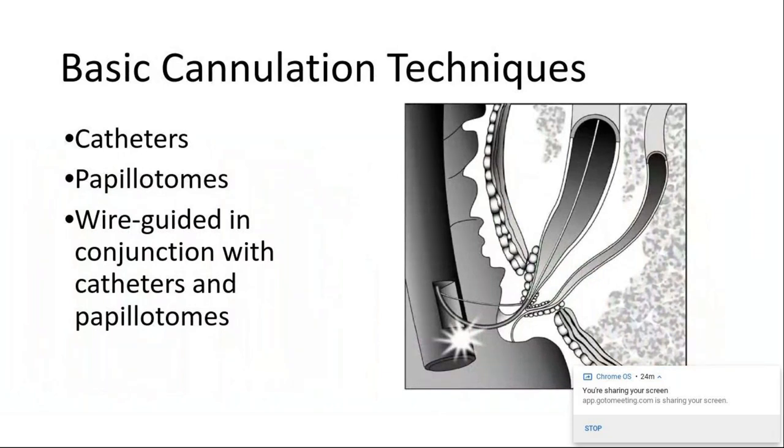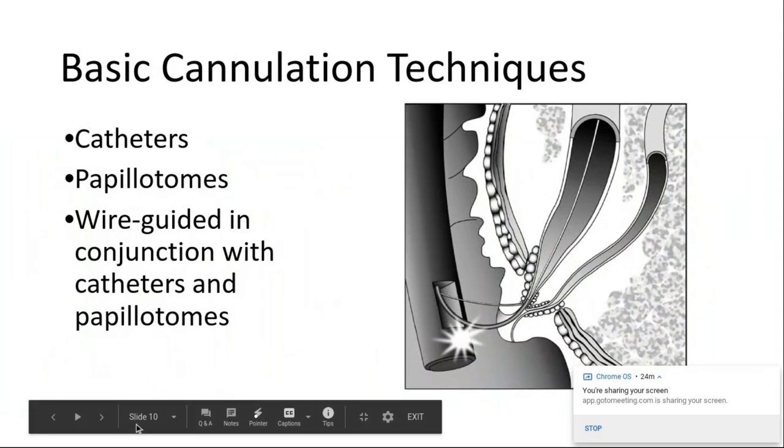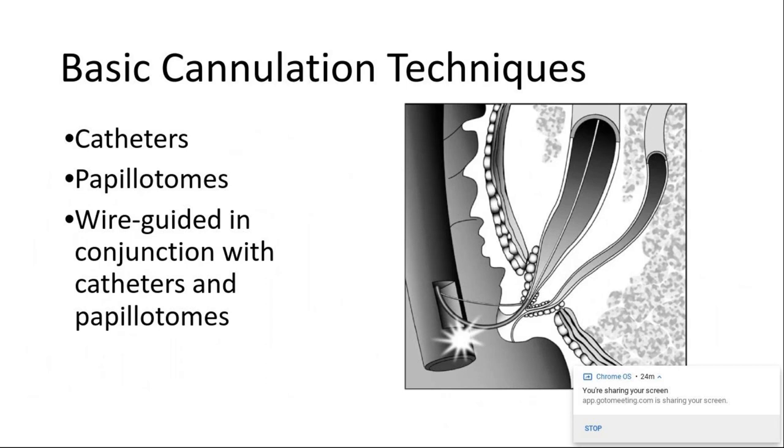The standard ERCP cannulas are typically 5 to 7 French catheters with a straighter, tapered tip that take a 0.035-inch guide wire. The use of a triple lumen cannula allows a preloaded guide wire and injection of contrast without removing the wire. Many endoscopists also use ultra-tapered 4-French or 3-French catheters for cannulation of tight bile ducts and pancreatic ducts, which can take a smaller guide wire down to 0.018-inch. No published studies have directly compared cannulation success between standard and small caliber catheters.